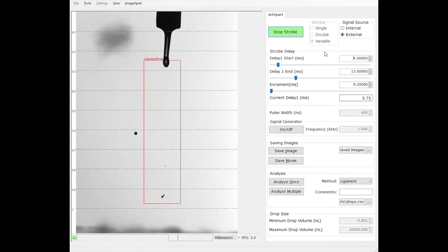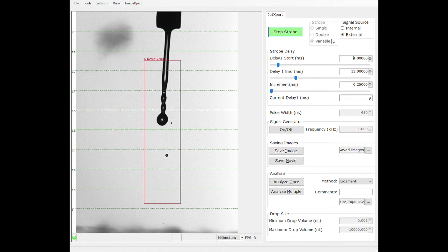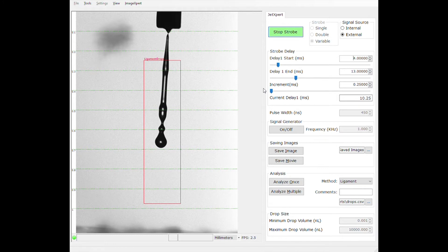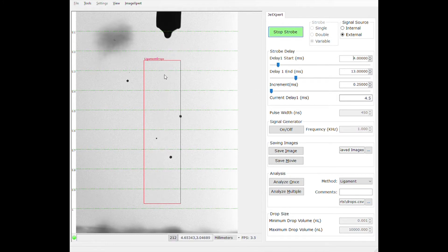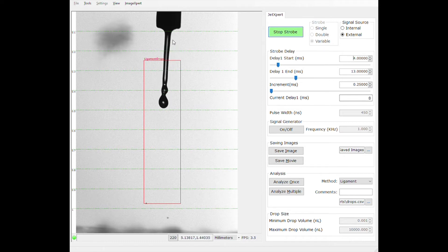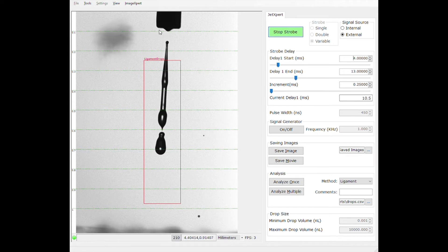As you can see, we're currently using variable delay, which is a mode that's good for visualization. We can see things like the stability of the drops over time, whether there's any satellite formation, or how long from the printhead or dispense tip it takes for the drop to fully collapse.